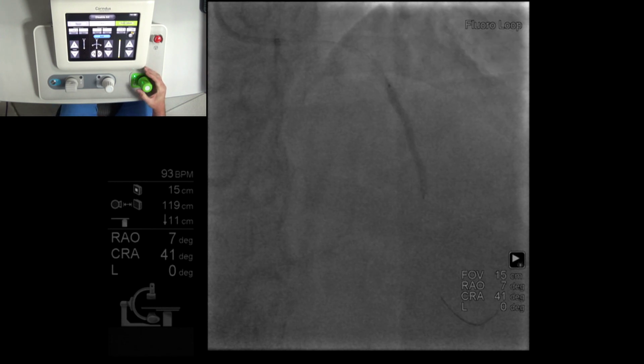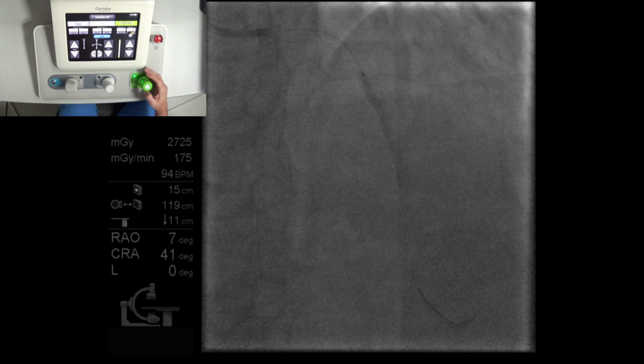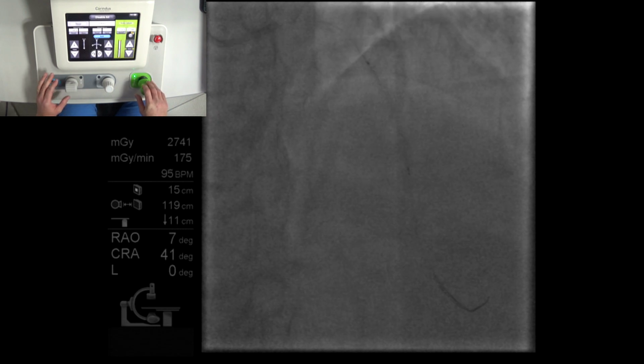All right. Tell me when we need to come down. Okay, deflate. All right. Now this will be the fun part. Please. Do you want to have any comment, Malcolm? No. So we're going to try to get this out without sucking the guide in too much. So I've backed my guide out. And remember, as the balloon releases, you'll have to re-advance the guide. I'm pulling the wire back a little bit. Yeah, that is a good technique.